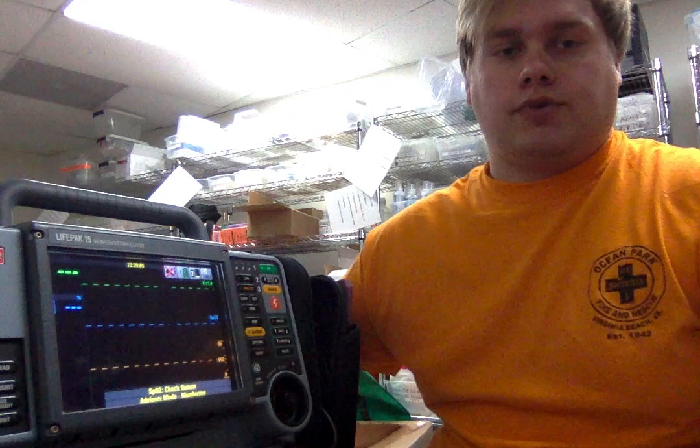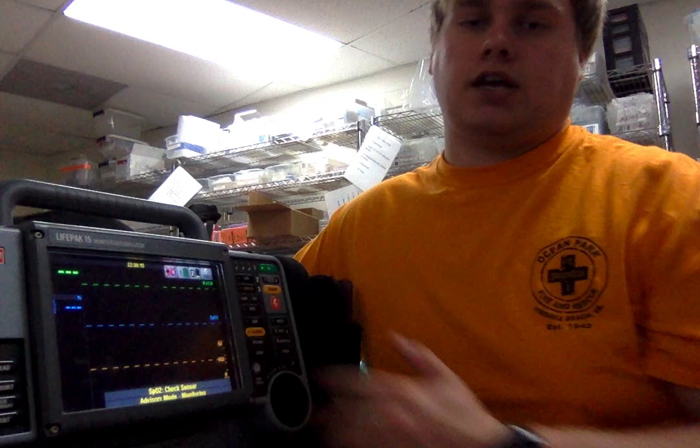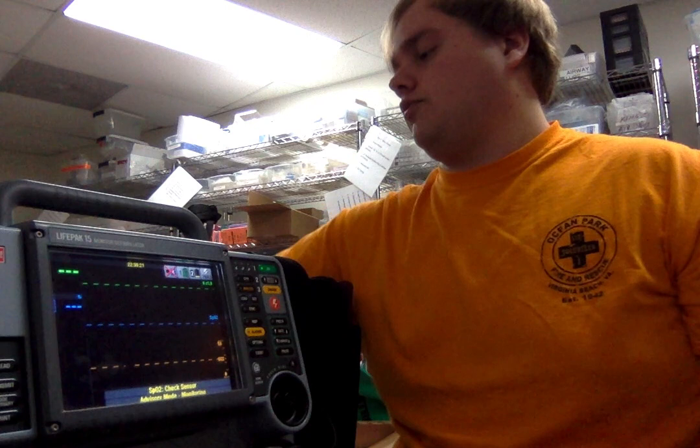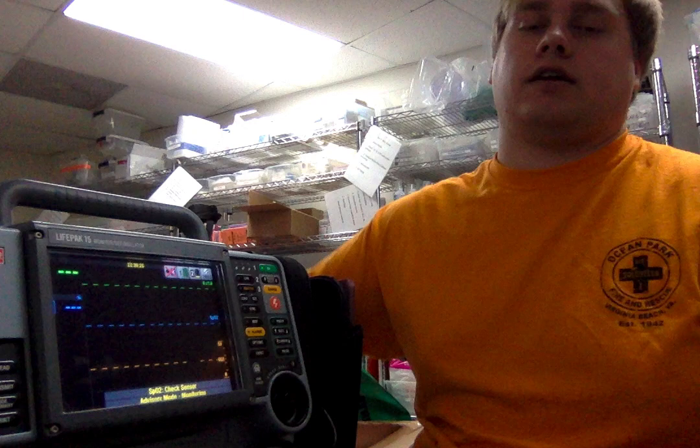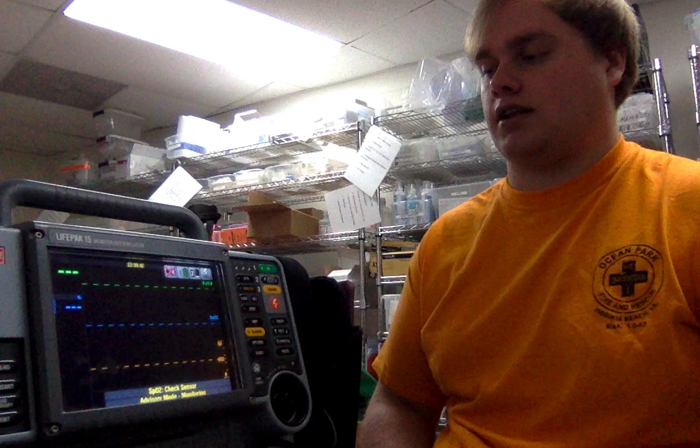In the back we have more storage for items such as the capnography like we were talking about before. These items when you purchase them will come with the cords, however do not come with the items in the back. This unit also comes with two batteries in the back, with the option to do a continuous charging or plugged-in version, which would allow you to keep it plugged in and then unplug it and it'll still have battery life on it. My agency does not have it spec'd out to that, however that is an option you're able to purchase.